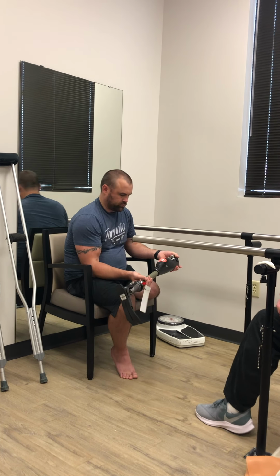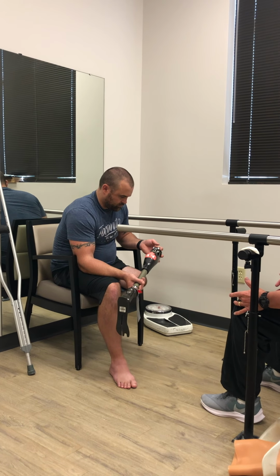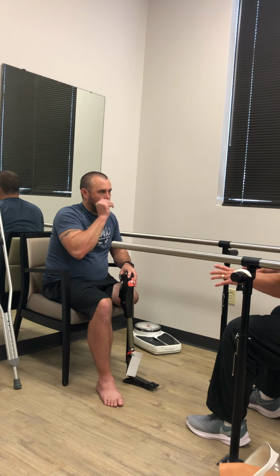What it'll be is just where the knee center is and how much concern you have over it being perfect. I'll get the height right. It's just whether it hinges exactly where the knee center is.